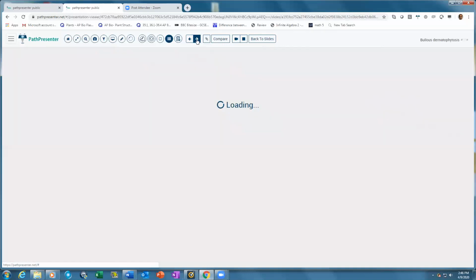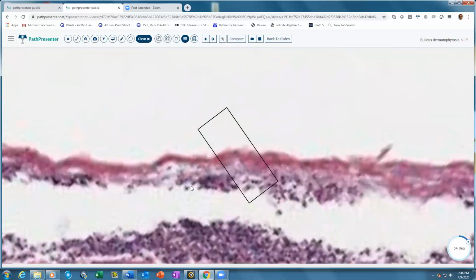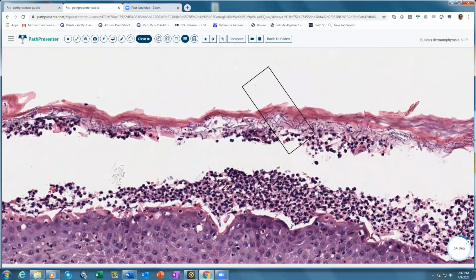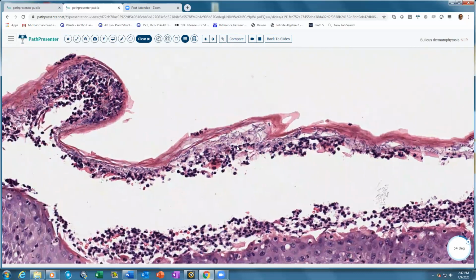And this fungus is easier to see in this one, where you can see the fungus here basically. So there's almost a fungal party going on. So you can see all these hyphae forms here, often associated with a lot of neutrophils basically. But many times you might not see the neutrophils, but if you see neutrophils, that is the first thing to think about, fungus, and then do a PAS stain, and many times you will save the patient a lot of treatment that is not needed, and which would be a very straightforward treatment by treating the fungus.